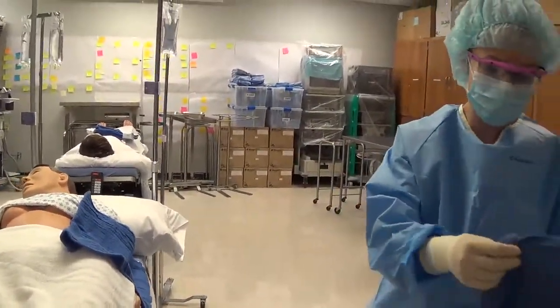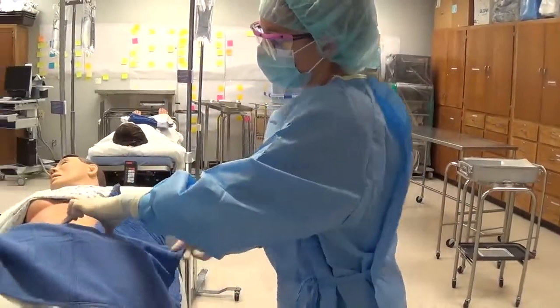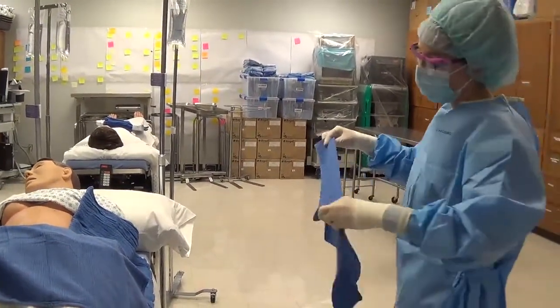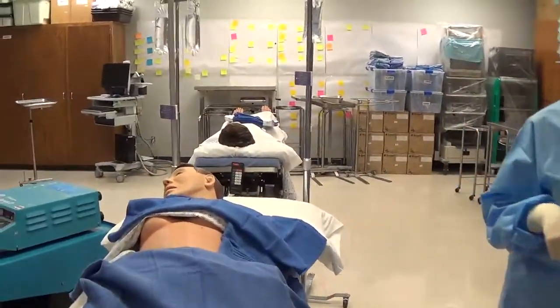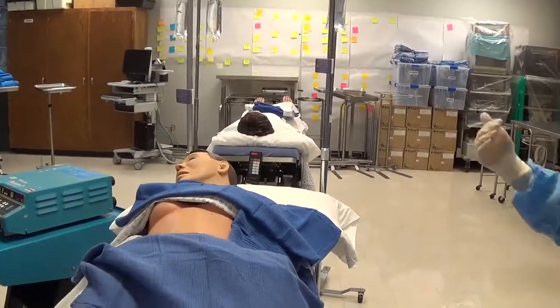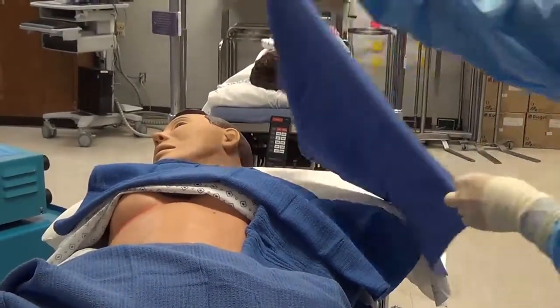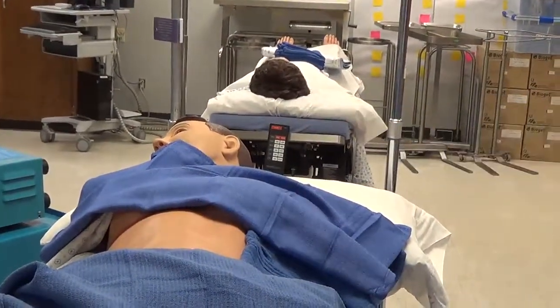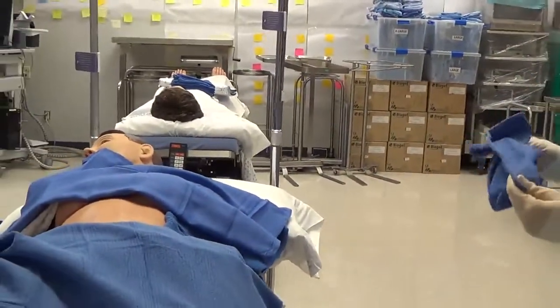Then we do the top or the bottom towel — again we make the fold away from us, swing out, cuff the hand, and place it. Remember we have to cover anything that's unsterile. If the patient's gown is sticking out, that's a problem — you shouldn't see anything unsterile near the incision area. Simply grab another towel and cover that area, because once you place a towel you can't bring it closer to the incision site.